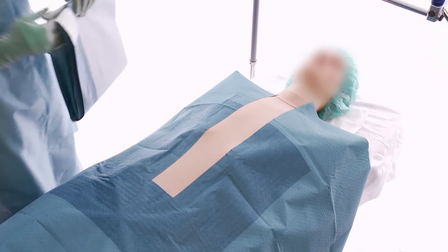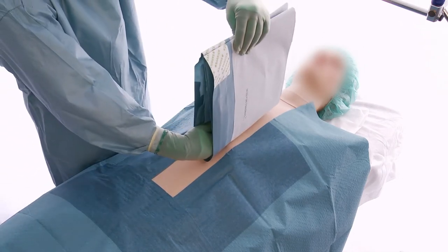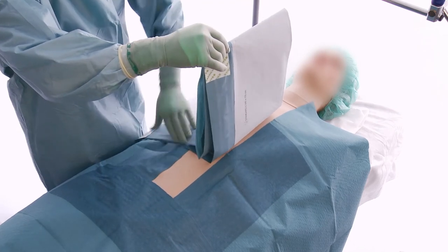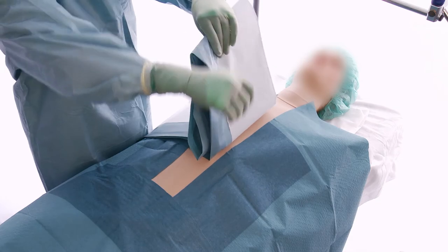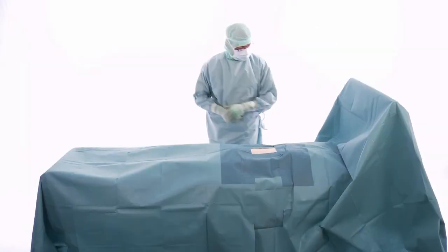Remove the middle release paper of the second OP sheet and place your hand inside the folding. Repeat the same procedure as before and unfold fully towards the patient's head. Draping is then completed.